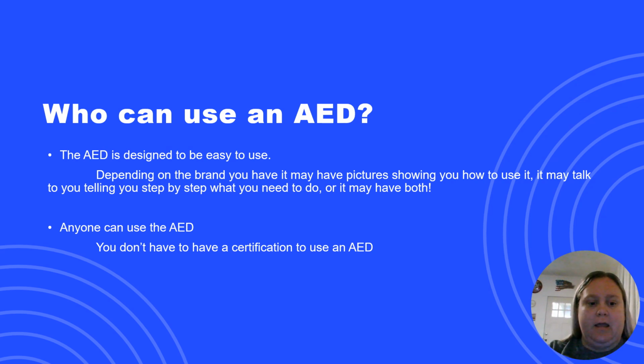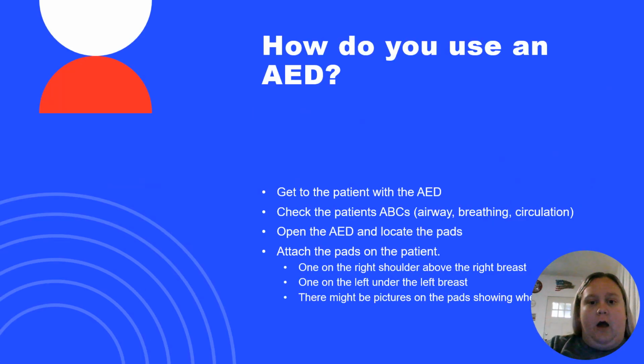So, all right. So how do you use an AED? Again, like I've mentioned numerous times, they all have pictures. They talk to you. So pretty self-explanatory. However, again, we don't want to get dependent on those.